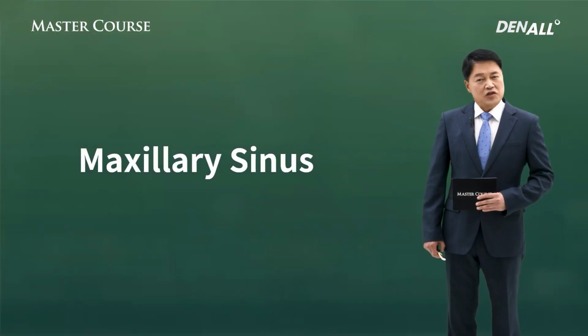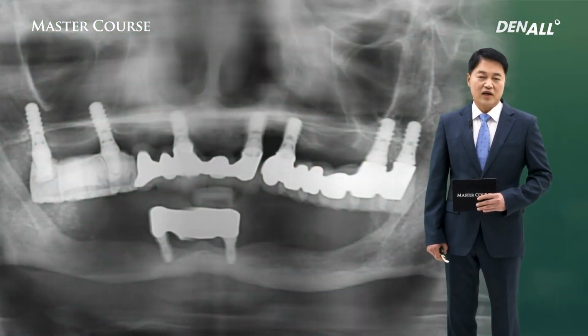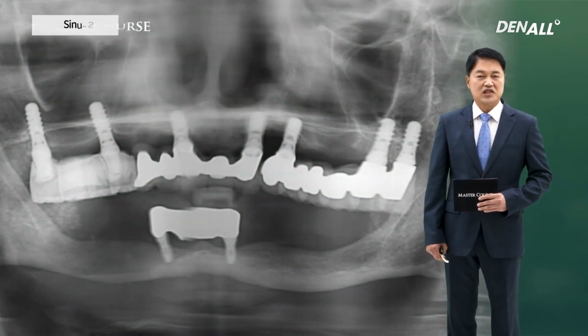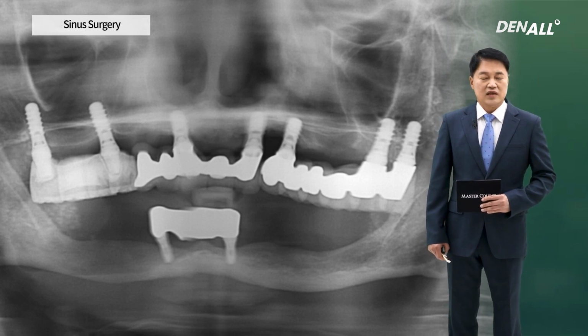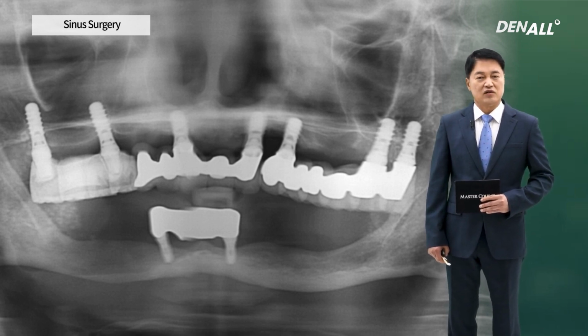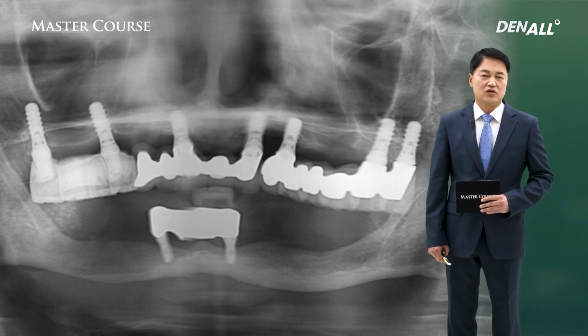Regarding sinus surgery, there's a very important message in this image. This is what I first took when the patient came in. The patient received implants from a different dental clinic. In the upper, there's bone resorption overall, and obviously one way or the other, implants were placed in the upper.